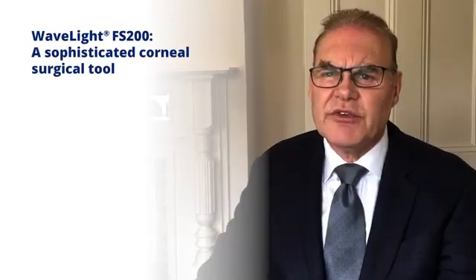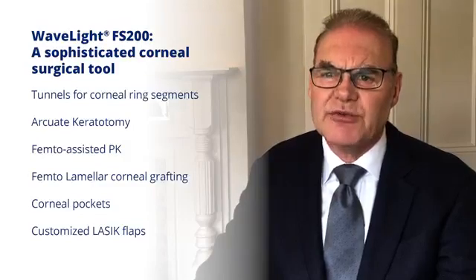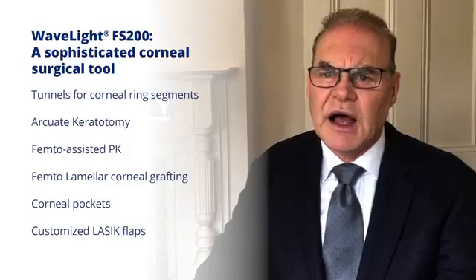So in summary, the FS200 is more than a simple adjunct to a LASIK suite making flaps. It's really a sophisticated corneal surgical tool that's got a lot of aspects to it. You can customize your flaps, you can use corneal pockets, you can very elegantly use tunnels for corneal ring segments. You can use it in the setting of astigmatism, you can use it in the setting of corneal grafting. And I think we will discover more and more varied uses for this surgical tool as time goes on. Thank you.